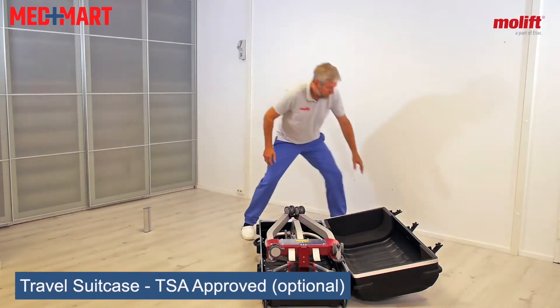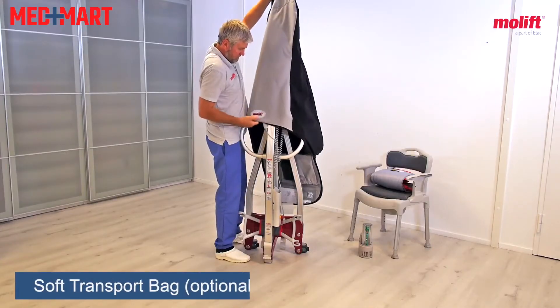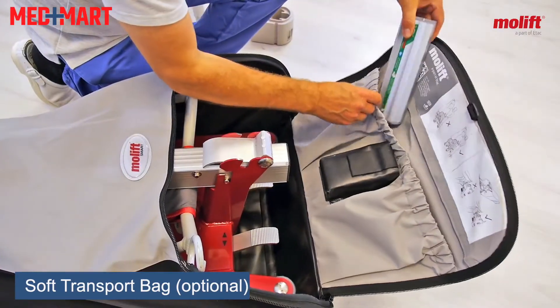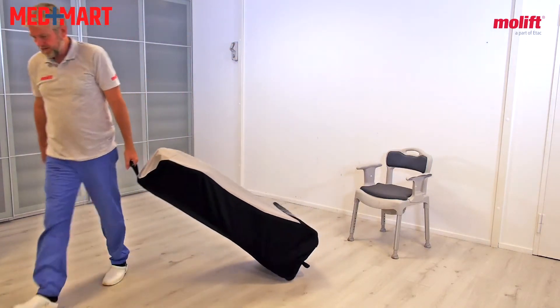If you want to fly with this, there's an ATA case available that makes it super easy to pack up and put on an airline. There's also a soft-sided bag that makes it super easy to pack into a bag — great if you're traveling to a hotel and don't want to be dragging a lift like this through the lobby.